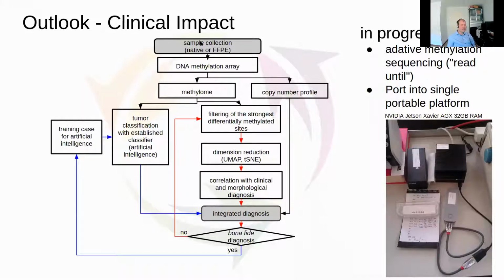What I think is, and we have seen similar slides today quite a bit, that this is an endless circle. It's an endless circle where you always start to feed in data, and you try to feed in, of course, in a very standardized manner, because that's key, so that the data and the annotation and also the clinical outcome data get recorded and get available, so that the system can be enhanced just by the simple number of data points.